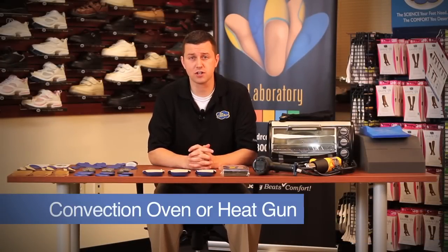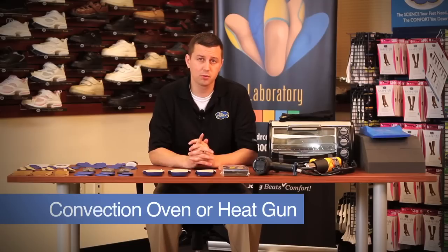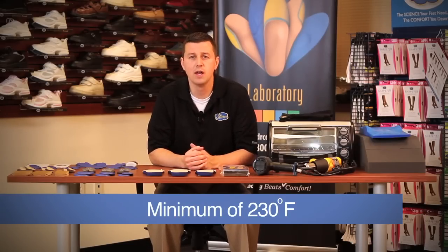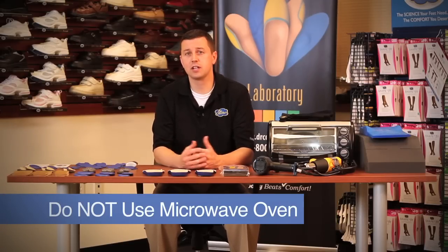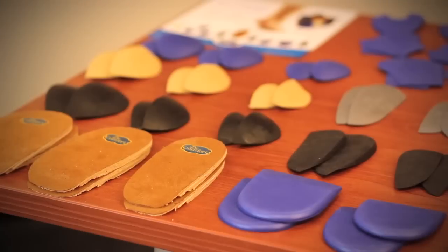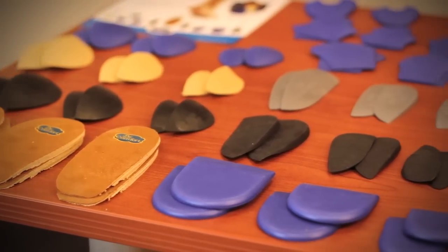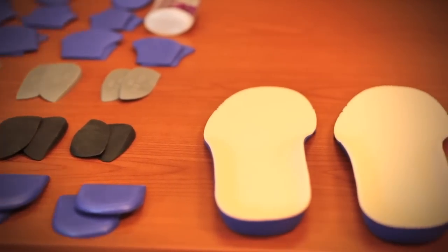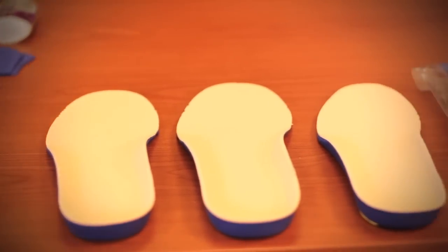In this video I will show you how to properly heat mold these inserts with either a convection oven or a heat gun, both reaching a minimum temperature of Medicare's requirement of 230 degrees Fahrenheit. It's important to note that you should not use a microwave oven to heat these inserts. We will also talk about the pedorthic modification pads we offer, which include arch pads, scaphoid pads, as well as heel posting and other pads to modify these inserts.